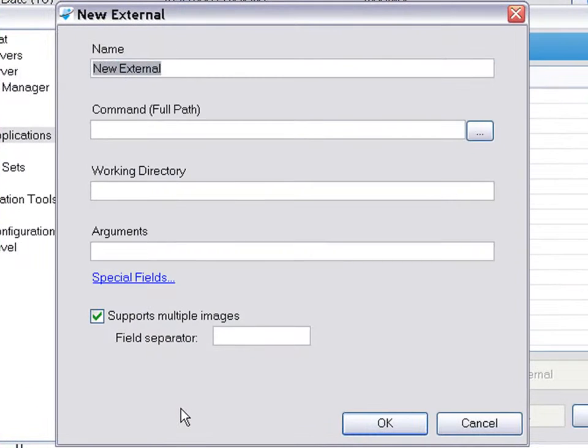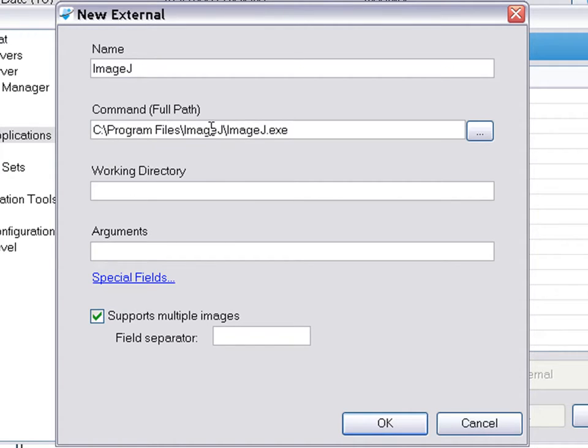Provide a name for the external application, provide a path to the executable, and provide any other necessary arguments.